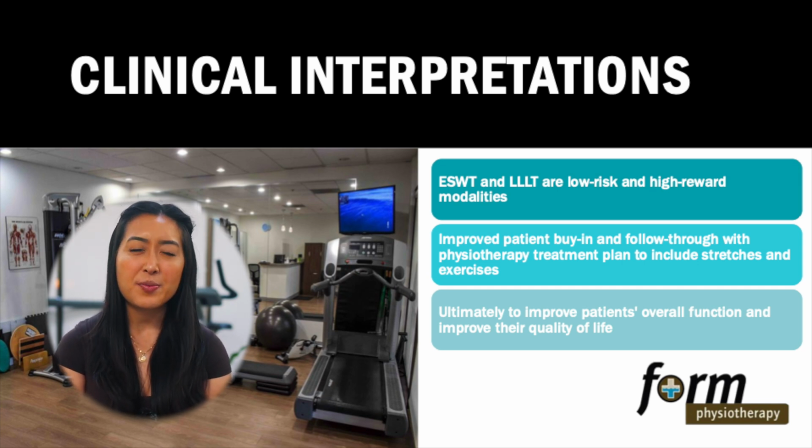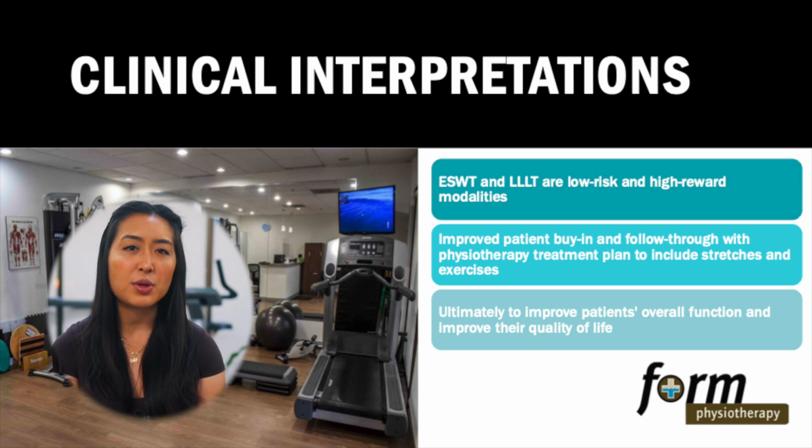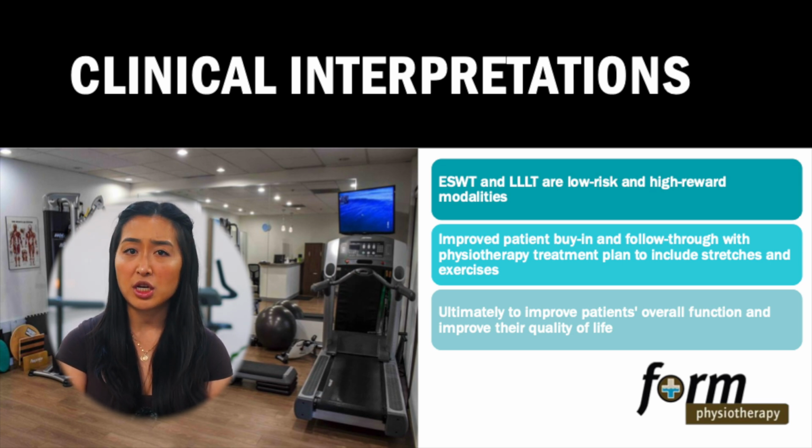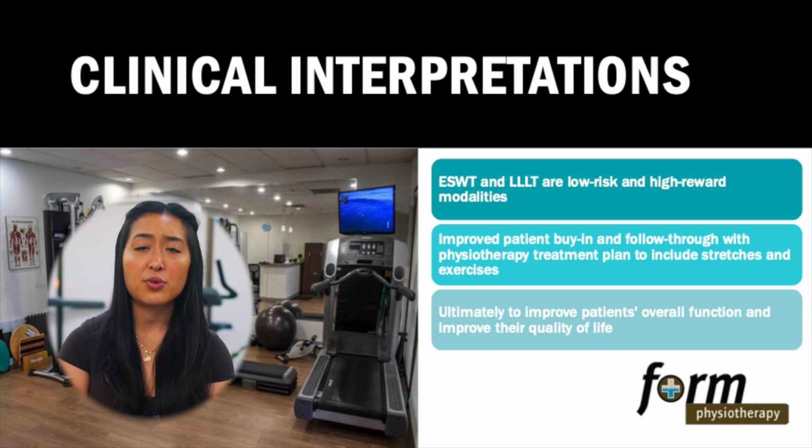But that initial patient buy-in can sometimes be tricky with patients who have perhaps lived most of their lives as sedentary individuals. Personally, I have found it to be very beneficial having shockwave therapy as an adjunct in my physical therapy practice, and I tend to use this modality in conjunction with education with my patients, exercise programming, and together also with some manual therapy and dry needling as needed.